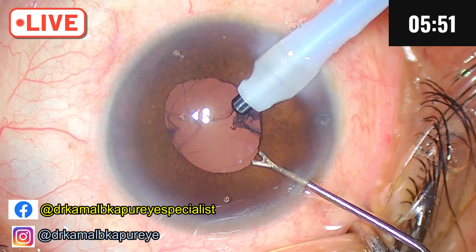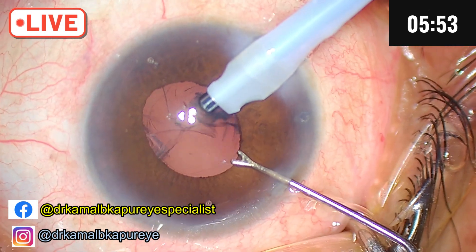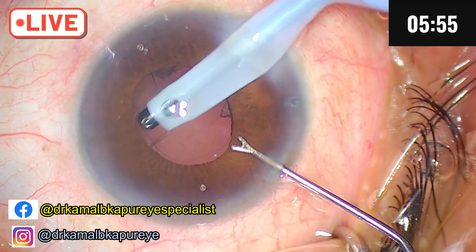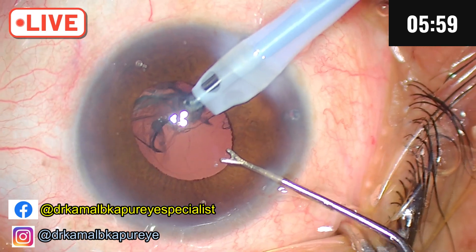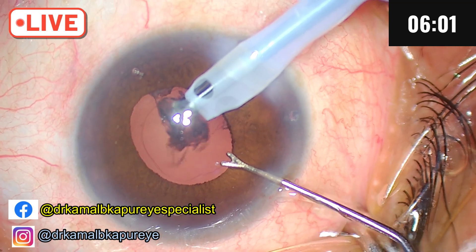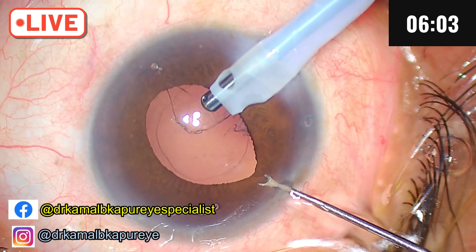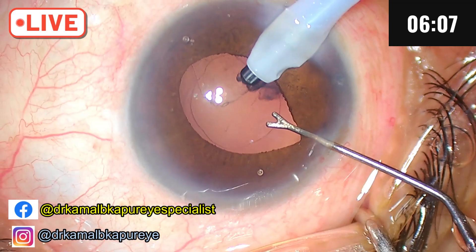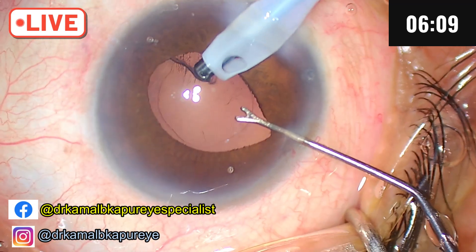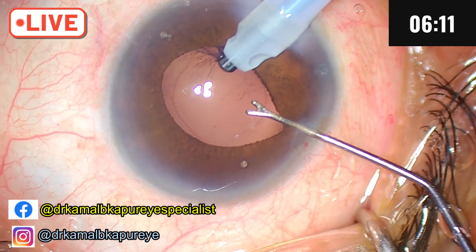I will keep dipping my side port so as to maintain a constant flow of fluid so that the IOP does not go up. Whenever I feel I am going to be stopping, it's a bit tricky to operate such cases because I am operating at a low bottle height. The patient has a compromised, advanced glaucomatous optic nerve.